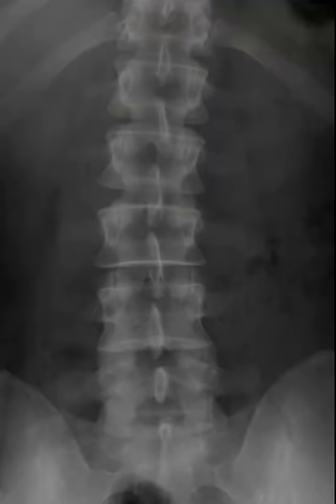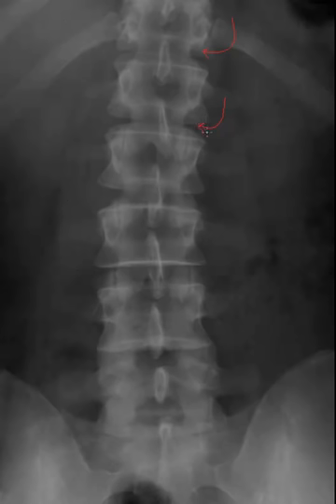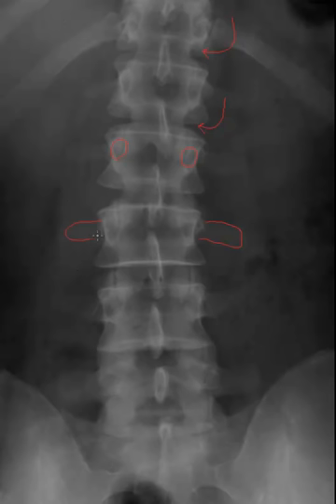Moving on, the intervertebral disc space is the lucent region between each intervertebral segment. Here are our pedicles, also known as the eyes of the spine, and here are our transverse processes extending laterally.